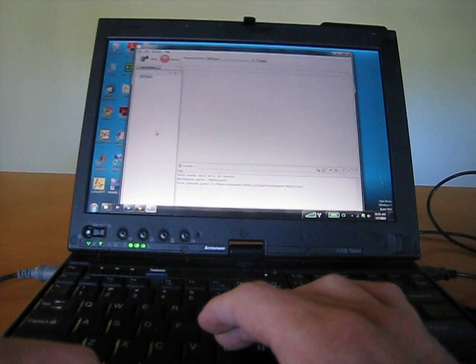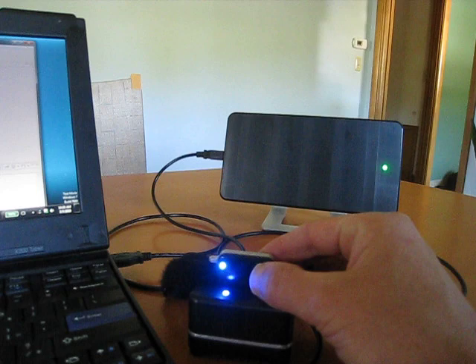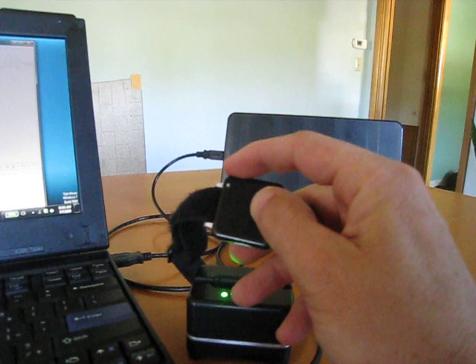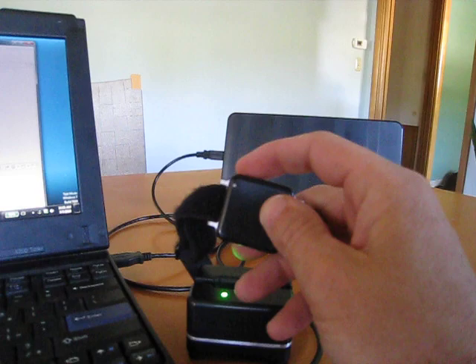The device has already been configured so I'm going to remove it from the docking station. When I remove it, this light turns green and this light turns green. The four flashes are an indication of the battery level and they flash periodically.